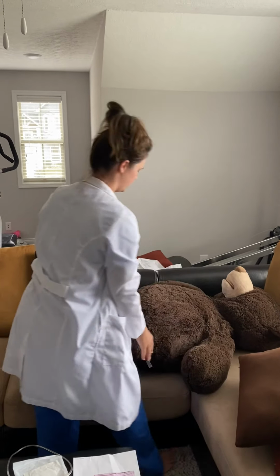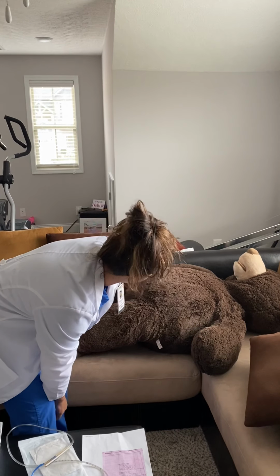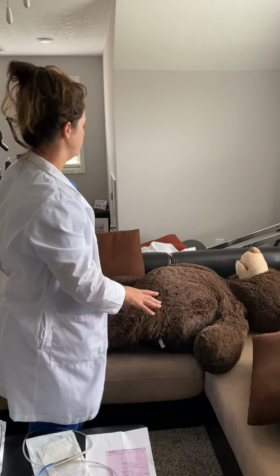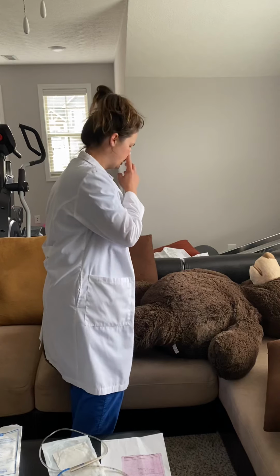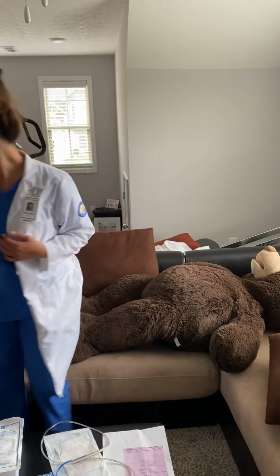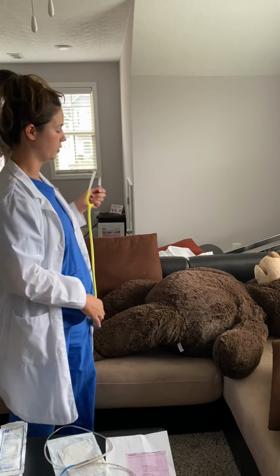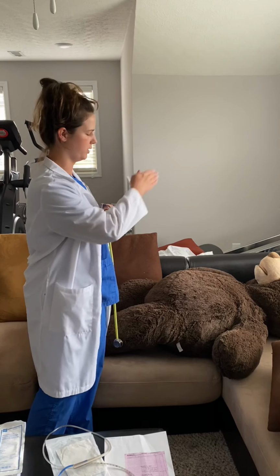So you first want to bend down and look at the abdominal contour and make sure there's no distension. Note your findings there. You want to look above the patient for any asymmetry. And then you want to auscultate and then palpate. So we're going to grab my stethoscope here. And starting in the right lower quadrant, you're going to listen to each of the 4 quadrants moving upward and down.